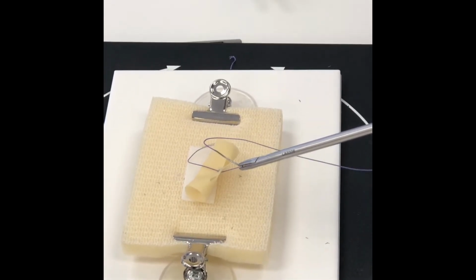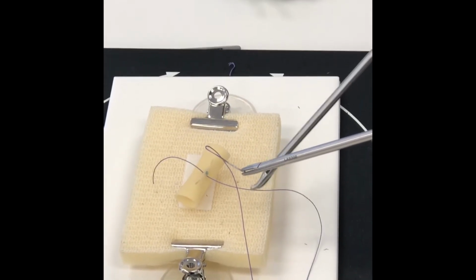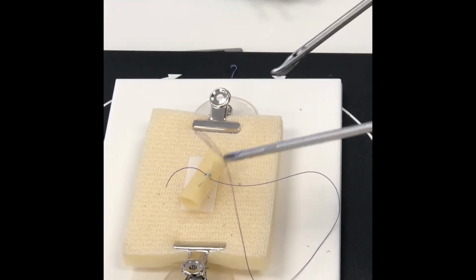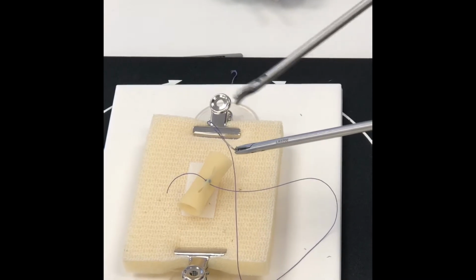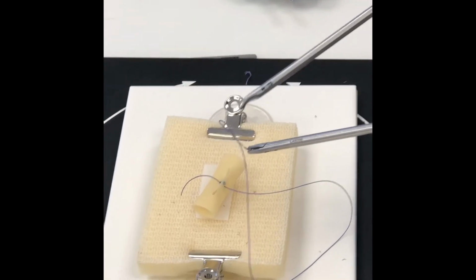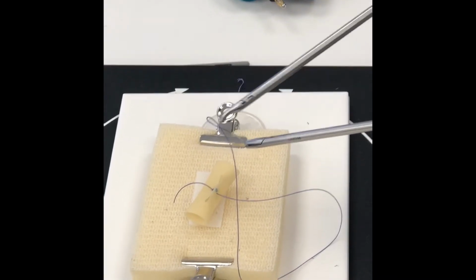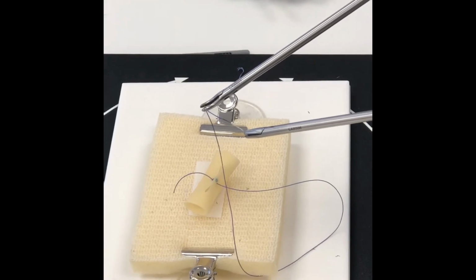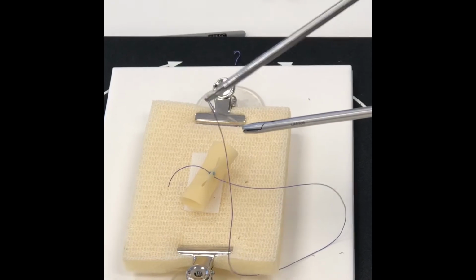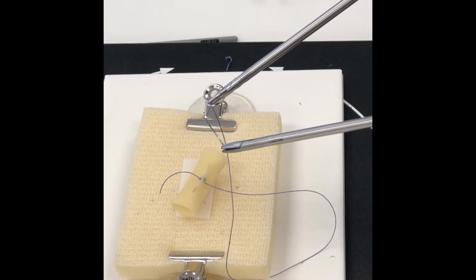The key is to not make your tail too long. So I actually make it pretty short because when you throw the first knot, it'll get longer. My first knot, I hold the needle so I don't let go. Most of the time I almost never let go, right? Now the angle that you're looking for is this angle between the needle driver and my suture, and I want that to make roughly a 90-degree angle. You see that? Here to here, that's the 90-degree angle that you're looking for. And I ignore the rest of the loop. I only loop around this 90-degree angle.